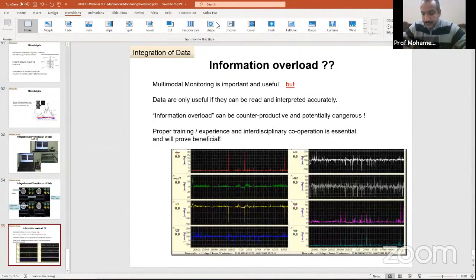Exactly. Second issue: when I start to do the monitoring, some protocols come before going to surgery, like hypothermia techniques and brain suppression. So if I am doing ICP monitoring without using the other alternative techniques for lowering the ICP, in centers where they don't have the hypothermia chambers or the brain suppression facility, do you think invasive ICP monitoring will be of value to skip these techniques, or do we consider whatever increase in the ICP is an indication for surgery if I don't have the other techniques for lowering the ICP?